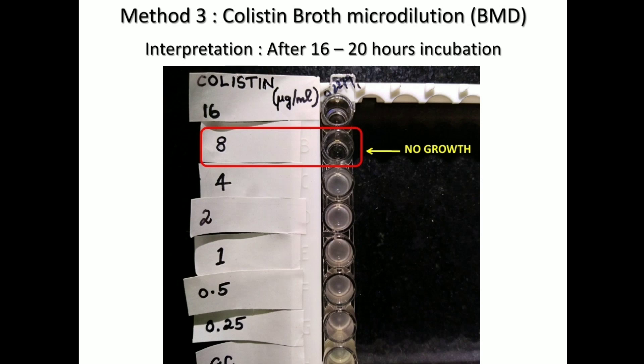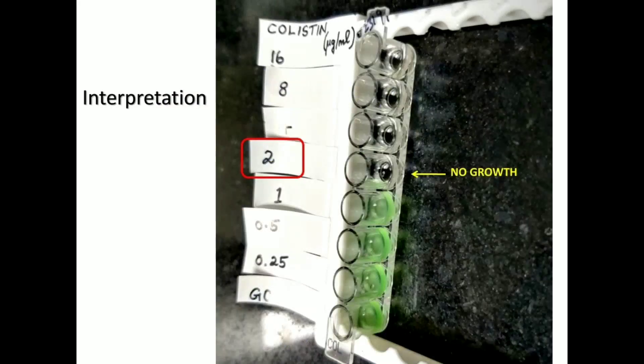The next isolate tested is a Pseudomonas aeruginosa, which makes interpretation easy based on its pigment and growth. Here you can see that the 2 microgram per ml colistin well has completely inhibited growth, giving an MIC value of 2 microgram per ml, which is intermediate.